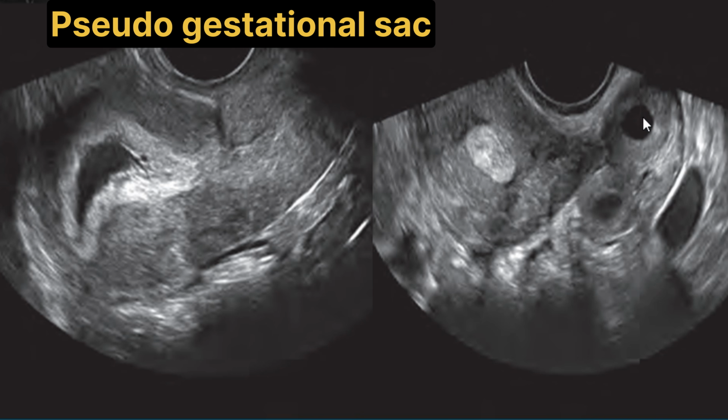Now in this sonogram we can see a left ovary. This one is the uterus, and this echogenic structure is the endometrial cavity of the uterus. And here we can see this structure is the corpus luteal cyst, and it also contains a rounded lesion with a hypoechoic center, present between the uterus and the left ovary, and this structure is likely to be an ectopic pregnancy. It is consistent with the adnexal ring.